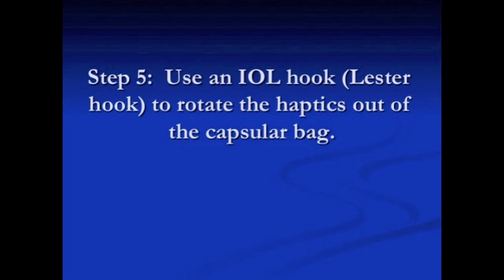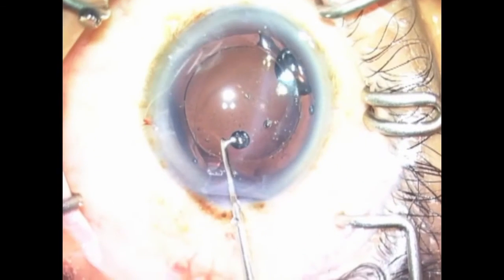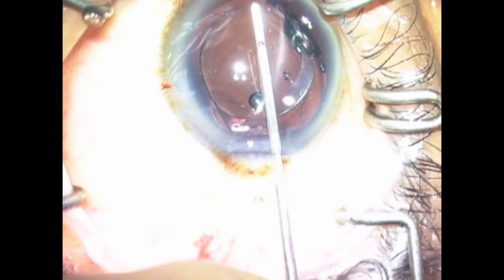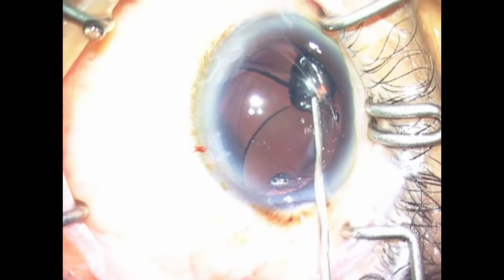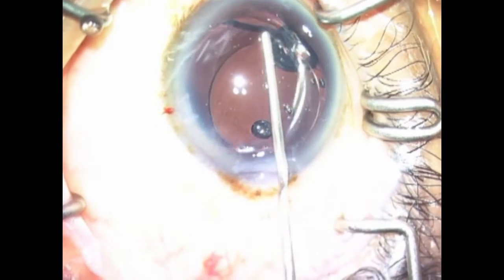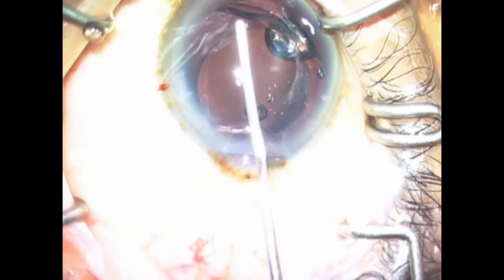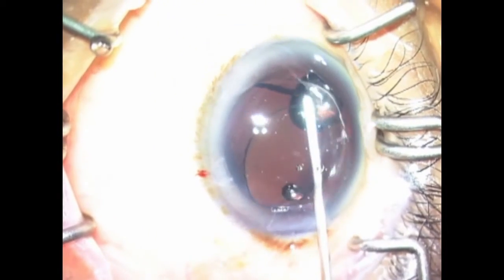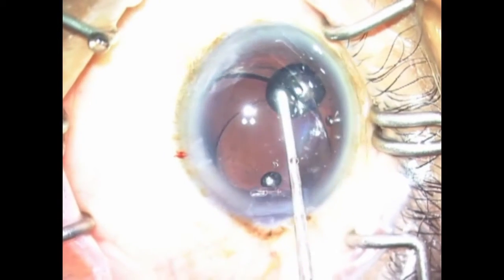Step 5. Use an intraocular lens hook, such as a Lester hook, to rotate the haptics out of the capsular bag. Step 6. If the haptic is stuck, additional viscoelastic is injected and this procedure is repeated until the haptic is freed.